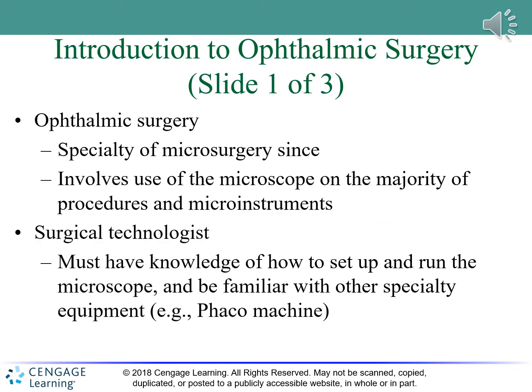Okay, so under the introduction, ophthalmic surgery is considered a specialty of microsurgery since it involves the use of the microscope on the majority of procedures as well as microinstruments.